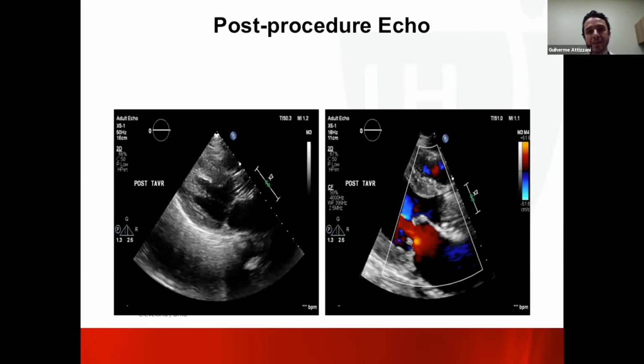Of course, respecting the fact that the valve is high and making sure that I'm going to have a good pacing capture, that I'm going to only call for pacemaker off when my balloon is completely deflated, right? Is there a risk of moving north? Well, there is a little bit of a higher risk. I think we have been successful doing that here.